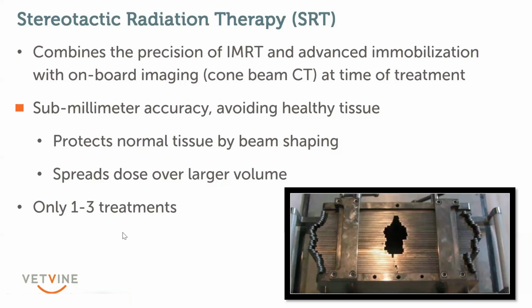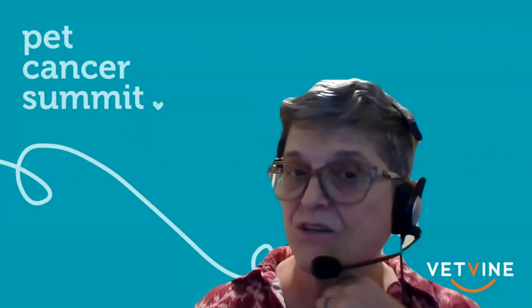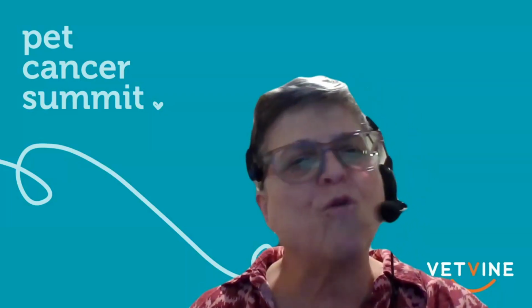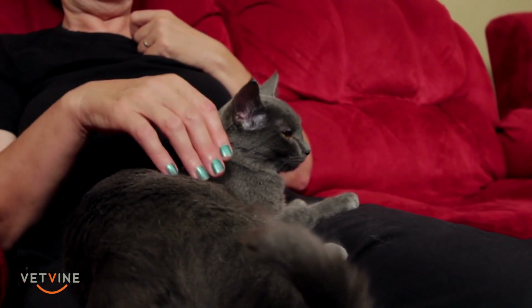allowing us to spread the side effects over more tissue, which doesn't sound intuitively great, but I have a good example I'll give you. And it really also lets us give a super high dose to the target area. So if you have a cat or cats, think about your cat sitting on your lap or on your chest, right? Their whole weight doesn't bother you. In fact, perhaps it is comforting.